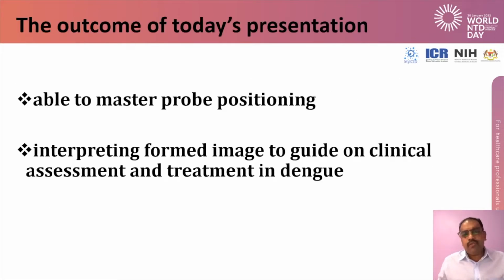So the outcome of today's presentation will be we should be able to master probe position and interpreting formed image to guide us in our clinical assessment and treatment in dengue patients.